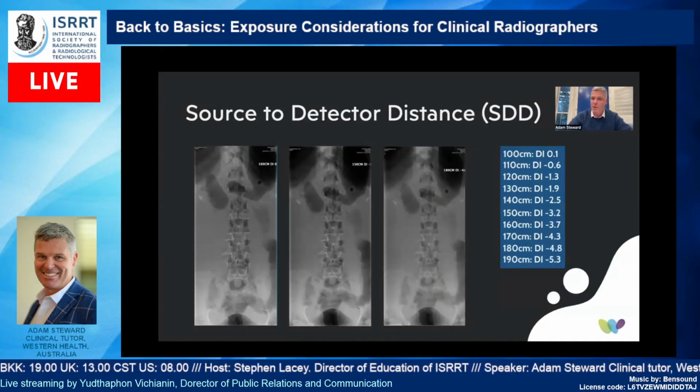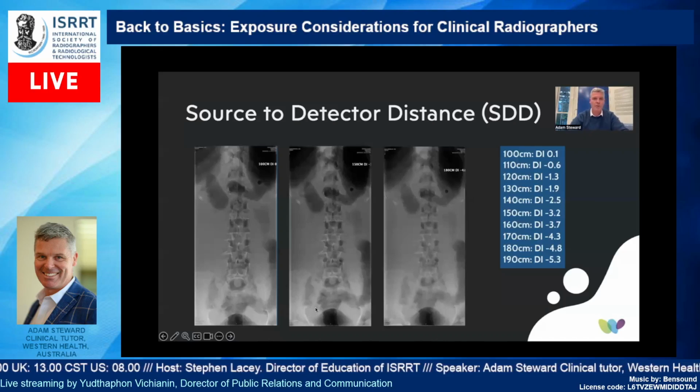Long story short, I'm not going to waste too much time on this either, but we had a look at our image. We took images over multiple distances, every 10 centimeters. Here's an example of 100, 150, and 180, common distances that we use in practice. You can see the big difference in magnification, and you can see the difference in intensity.